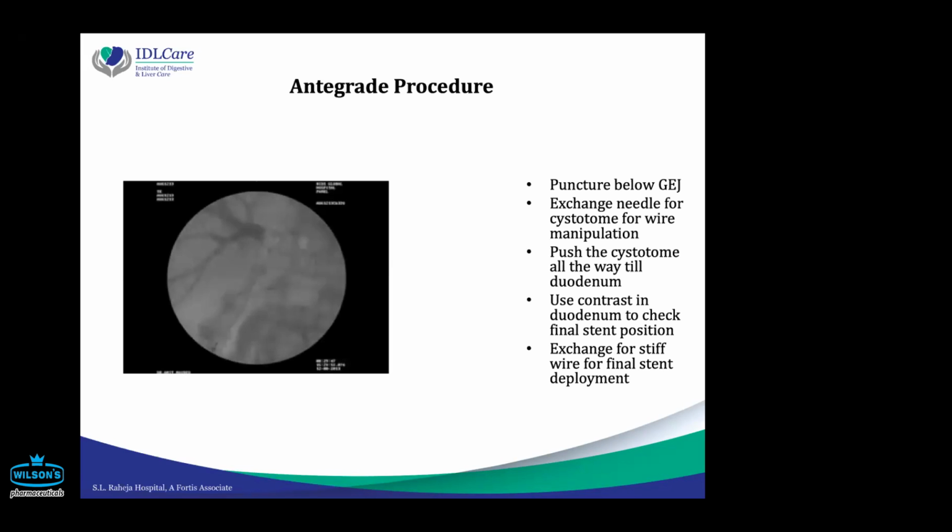The problem is passage of wire across the papilla is a technique which needs to be learned. It can be learned, not a problem, but it is a technique which needs to be learned. I'll spend a little more time on antegrade later.